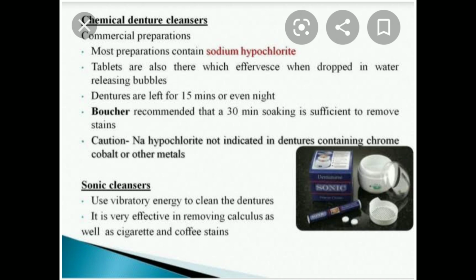Caution, the important thing is sodium hypochlorite is not indicated in dentures containing chrome, cobalt or other metals. And there are ultrasonic cleansers also, which use vibrator energy to clean the dentures. It is very effective in removing calculus, or if the patient has cigarette and coffee stains, right?